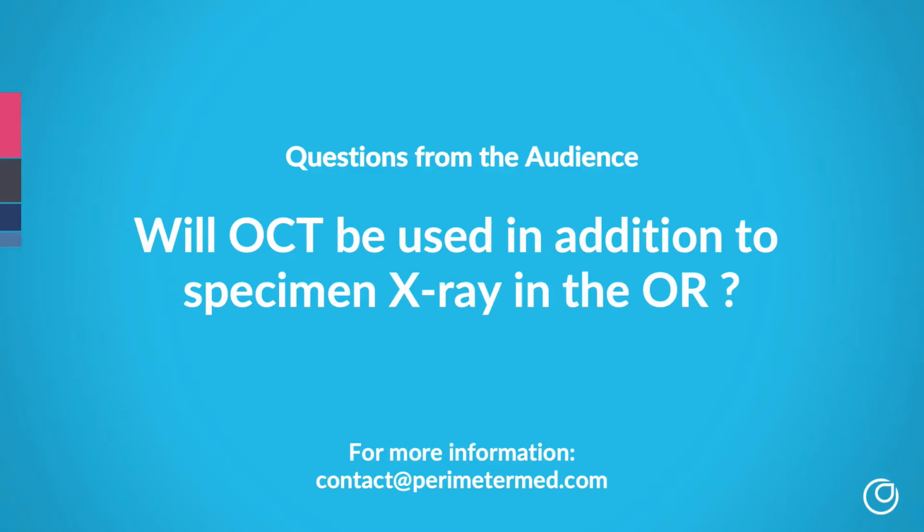Right, so this one came up a few times. Will OCT be used in addition to specimen X-ray in the OR? I think we all recognize the importance of using specimen radiography to ensure that we achieved our target in the form of documenting that the clip has been removed. And so I think this will definitely be a companion. Both techniques will be used together.